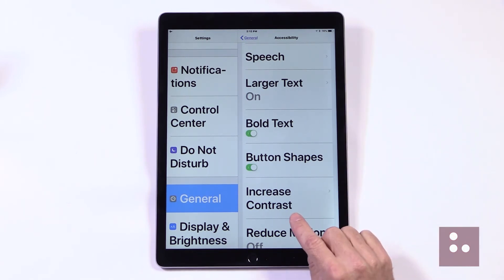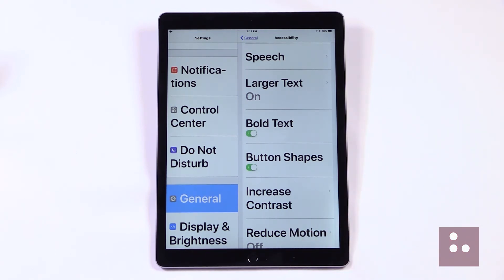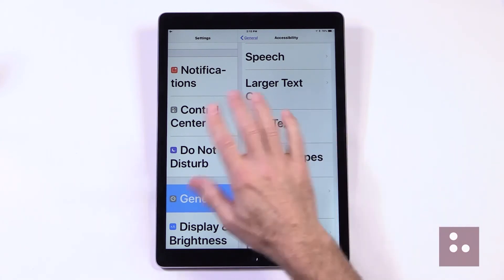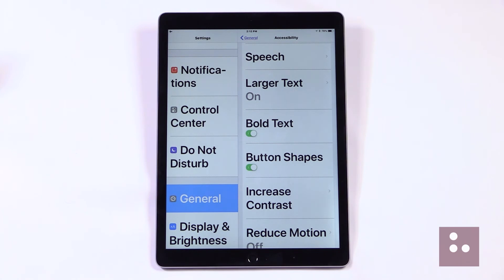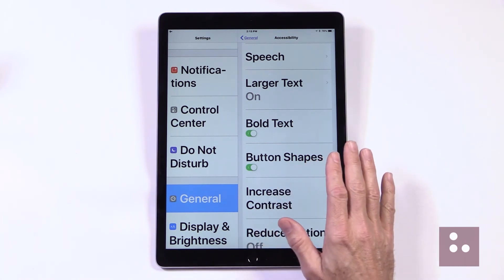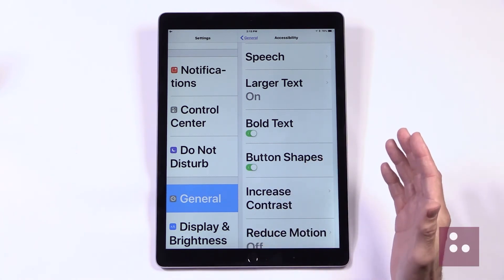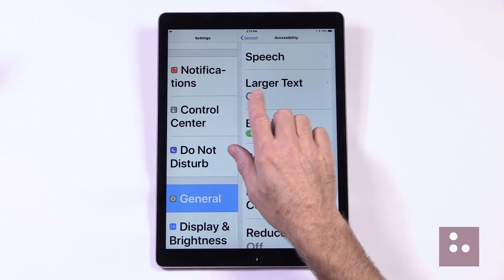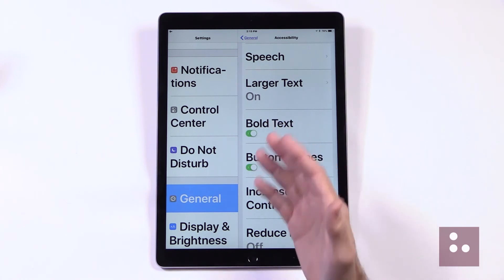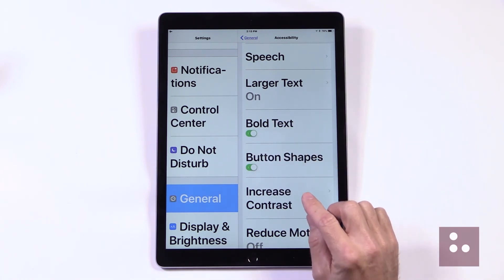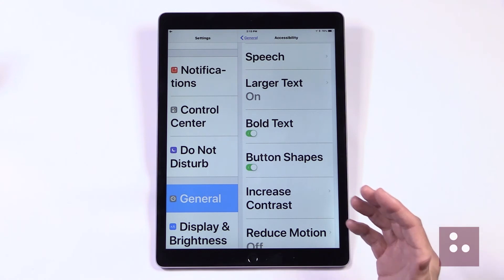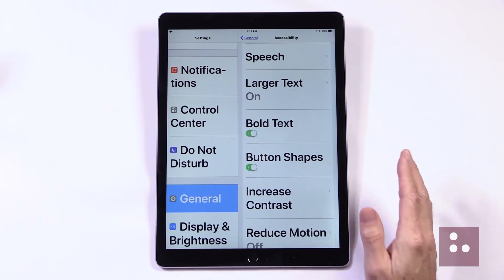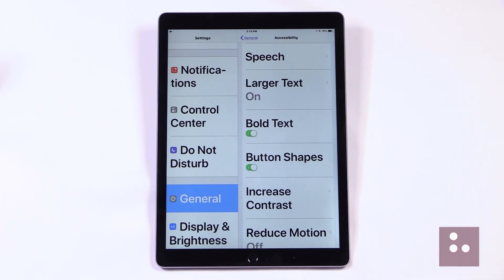Our next feature is our Increase Contrast feature. As visually appealing as iOS can be with its transparent backgrounds and muted pastel colors, it really gives some low vision users difficulty in determining what's a background and what's relevant text. Our Increase Contrast feature is going to give us a nice, bold or solid background that's going to make our screen's text so much easier to see.